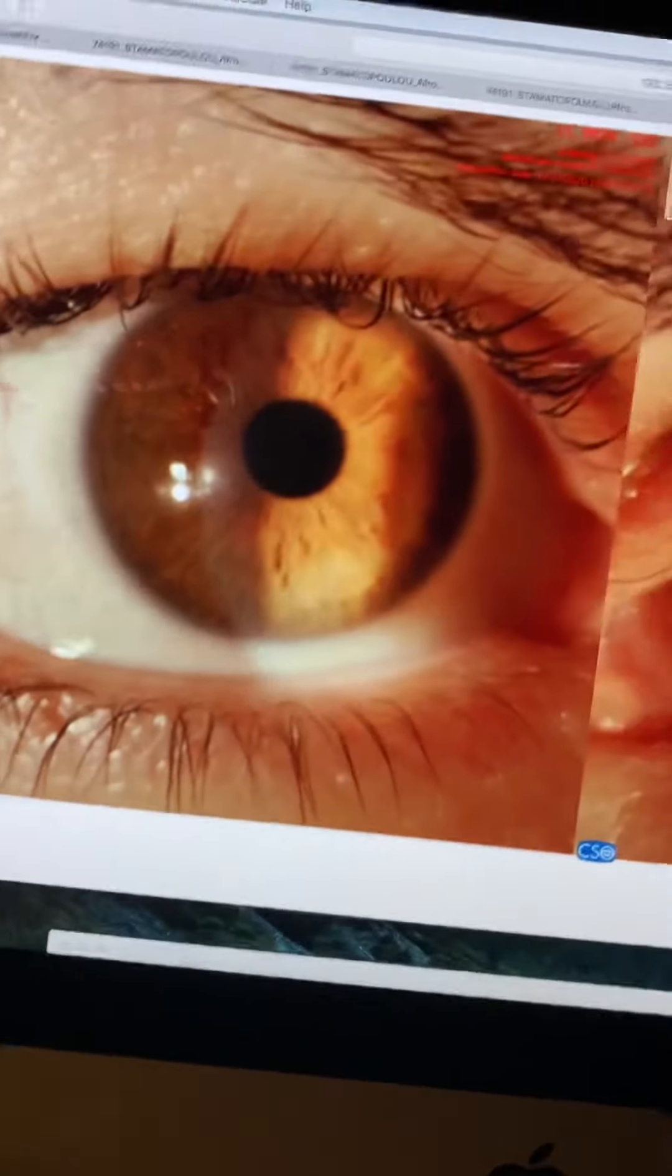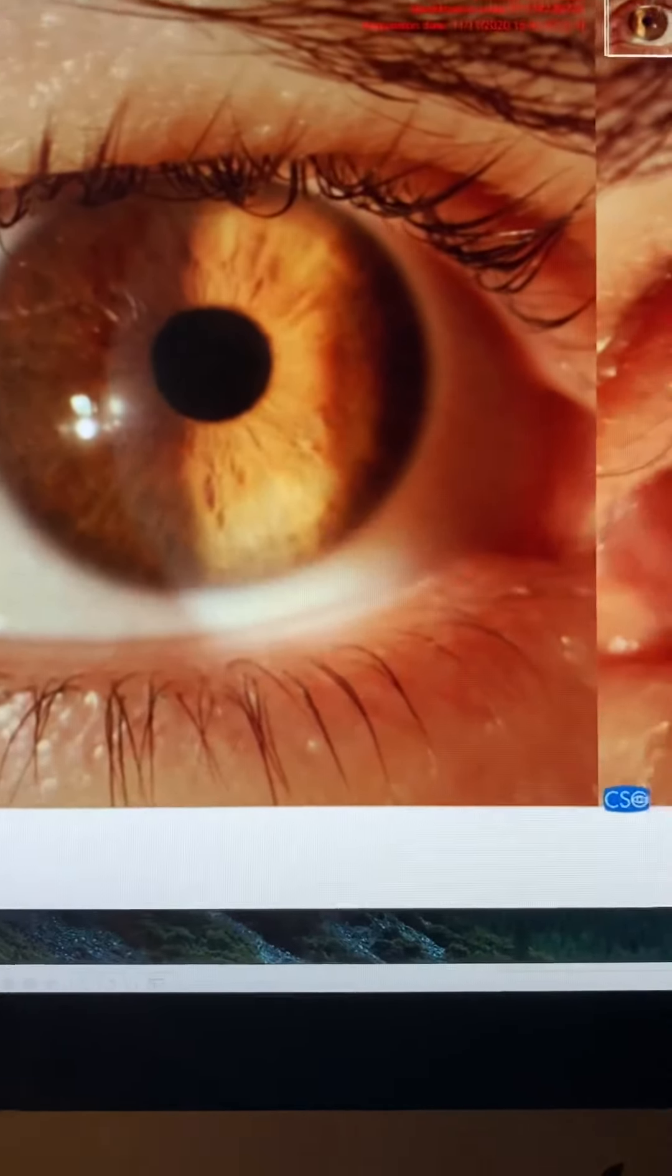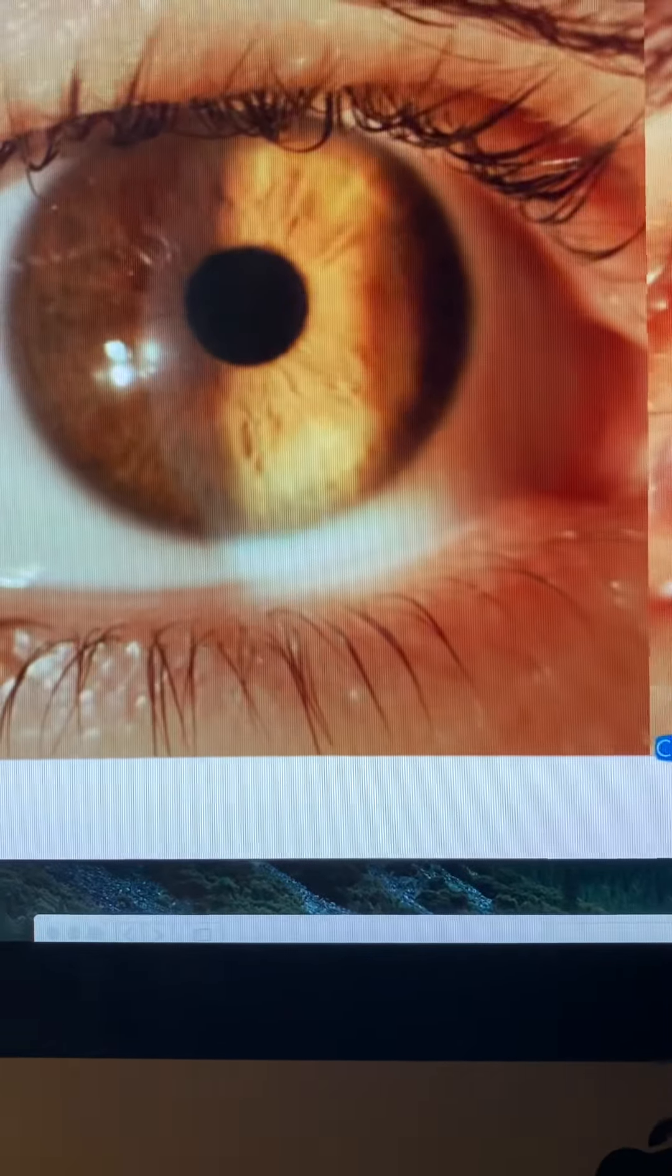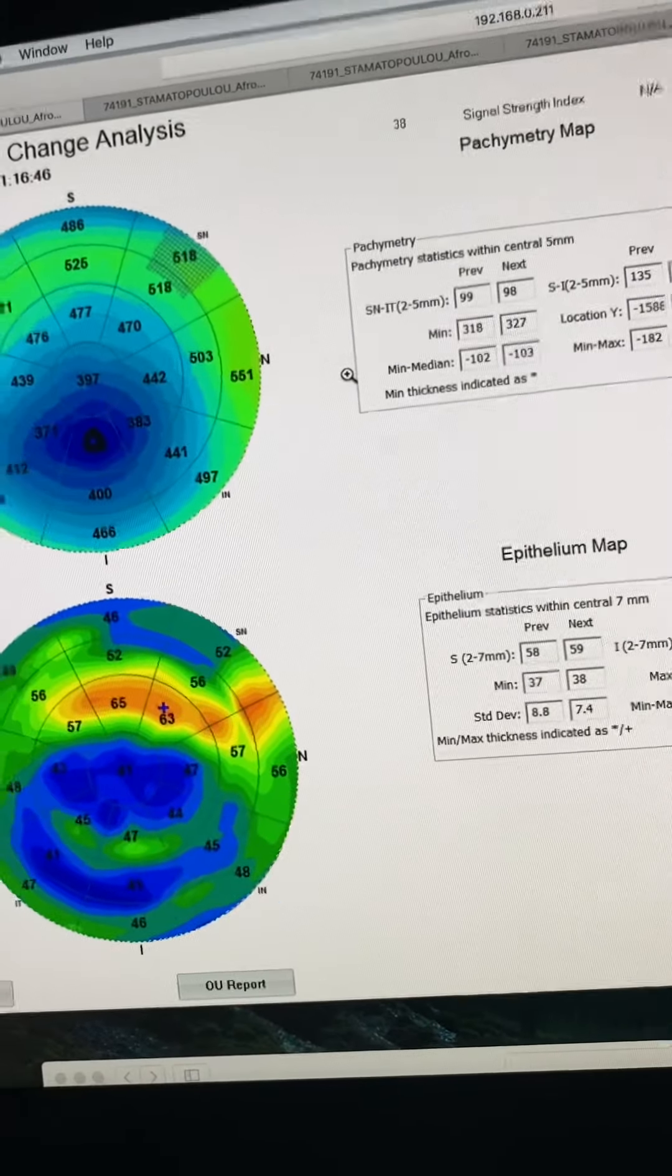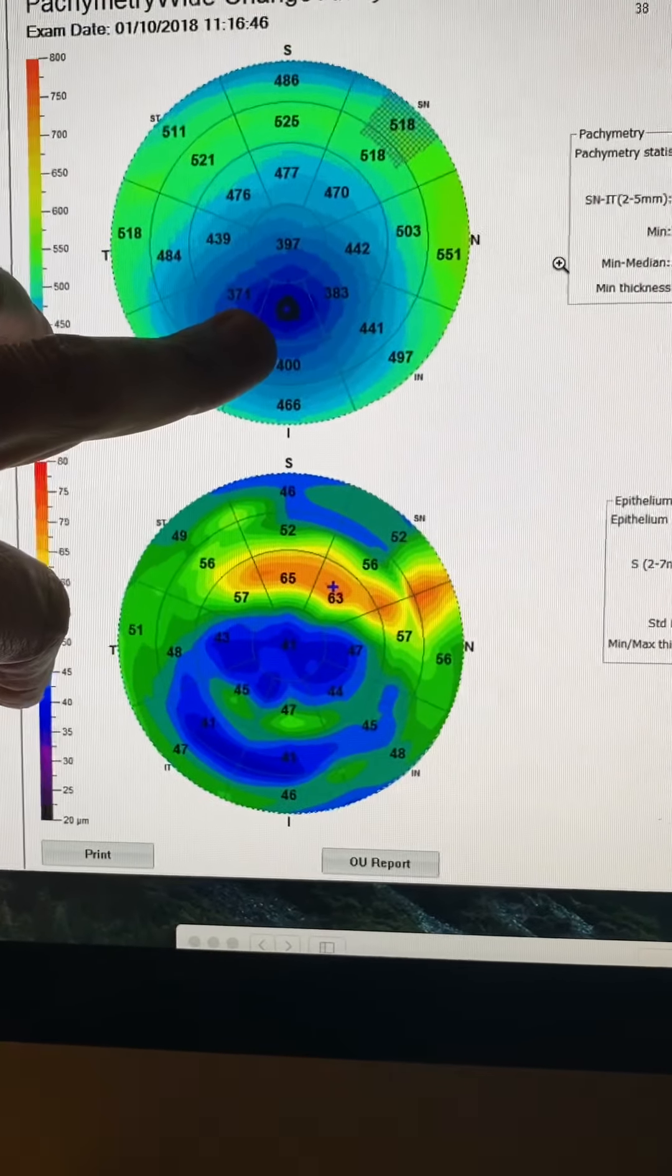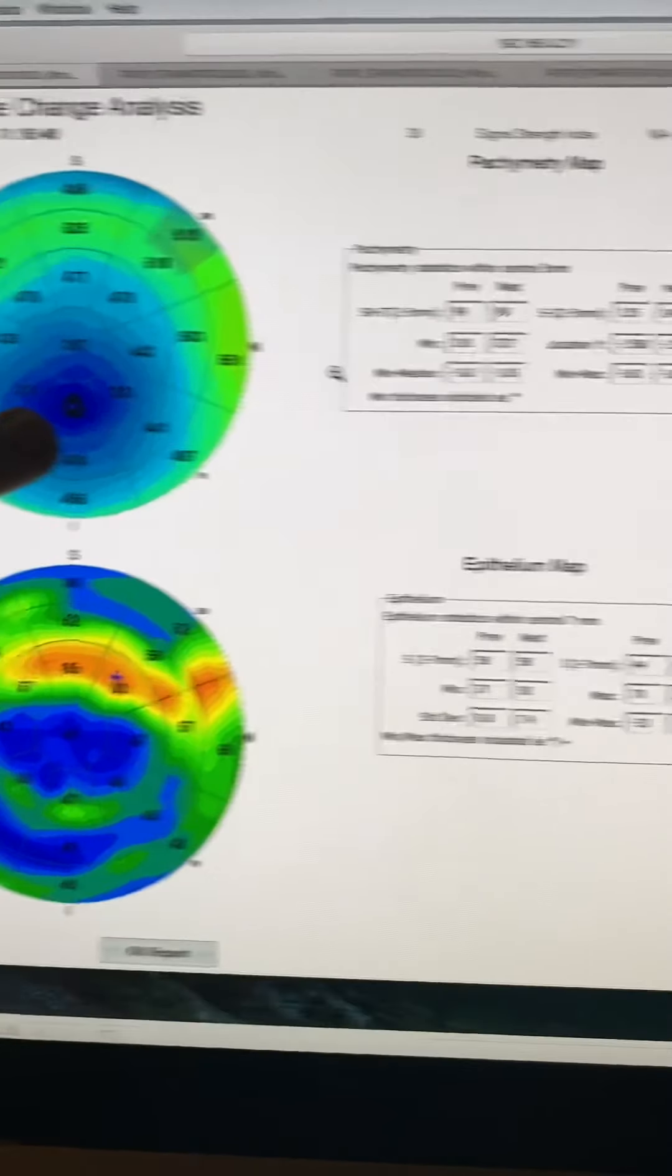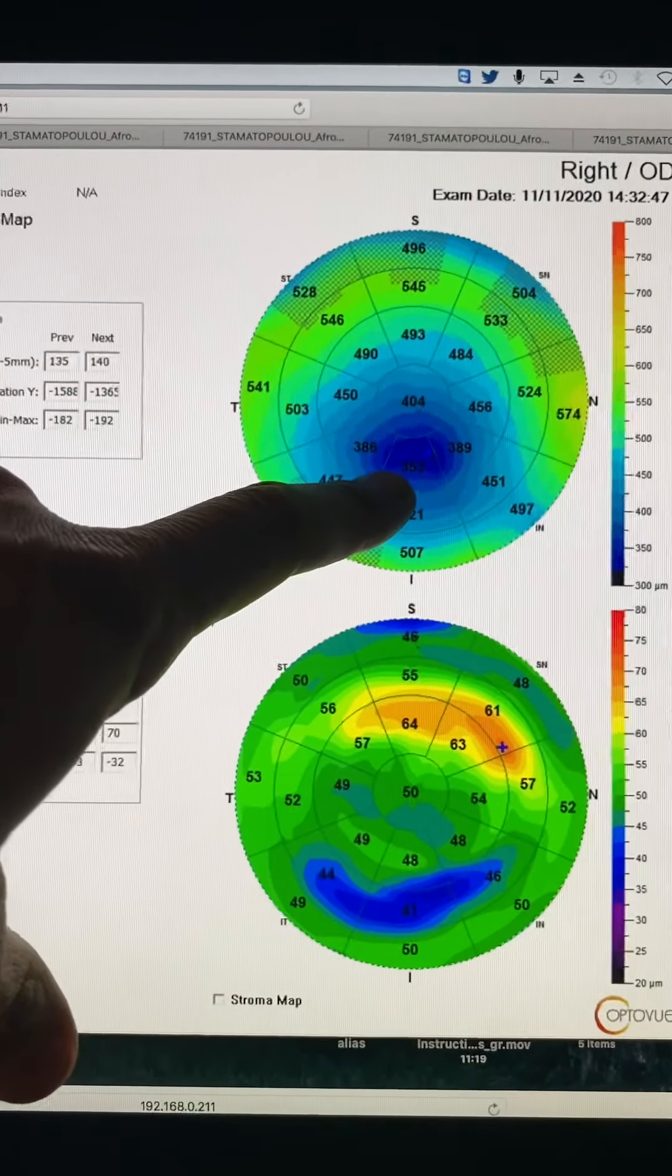First, we're going to look at some epithelial maps. Let's take a look at this. This is comparing a year after the procedure. We can see how thin the cornea is here on anterior segment OCT. We can see that miraculously, the cornea looks thicker today.